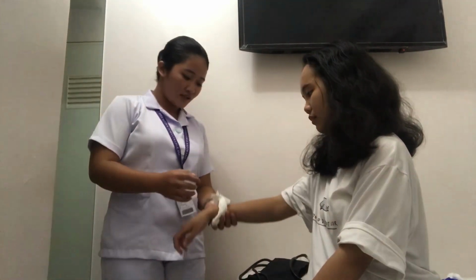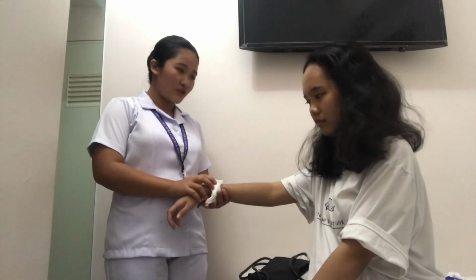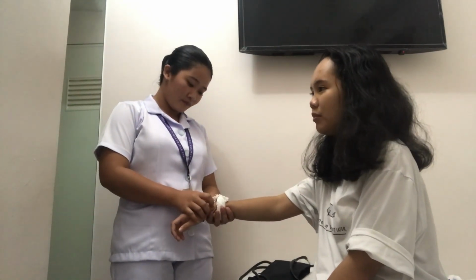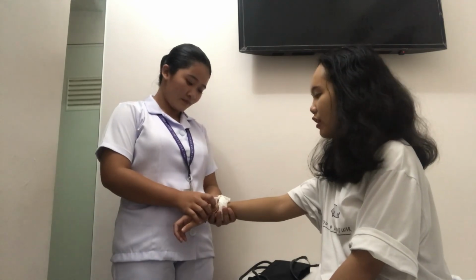So good afternoon, ma'am. I'm Kate Bayansi Icona, your student nurse for today. So ma'am, can I see your wristband? So please state your name and your birthday. My name is Mia Monica Peralta and my birthday is on June 15, 2003. Okay, so thank you so much, ma'am. So now I'm going to take your body temperature. I'm going to put a digital thermometer in your mouth so I'm able to take your temperature. Is that okay with you, ma'am?